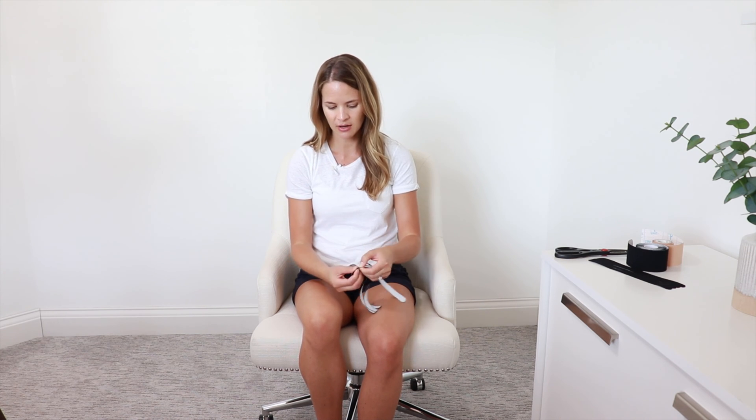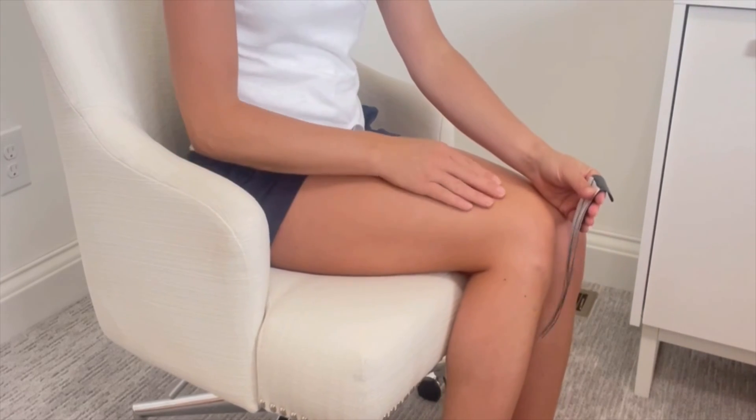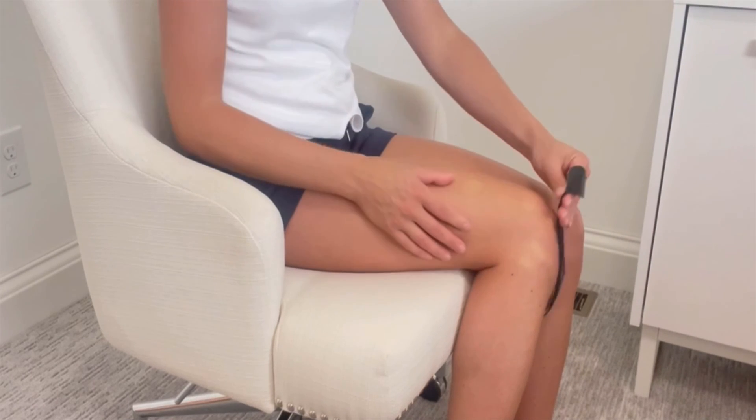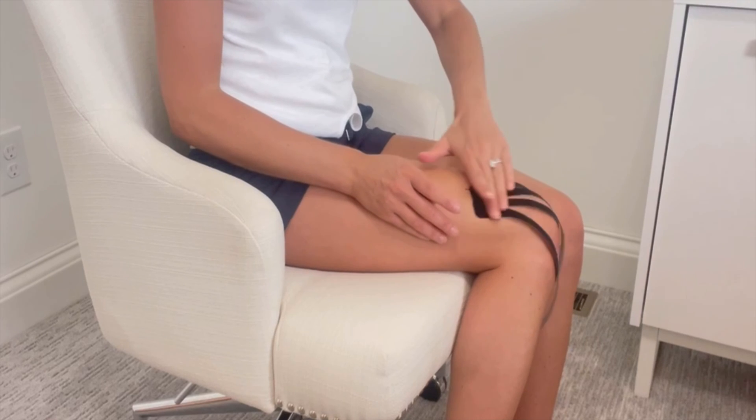Remember, make sure that you don't have any oils or lotions on the knee or the skin before you apply it. When it comes to knee swelling, we really want to get as much full coverage over the area that's swollen as possible. We'll do one strip on the inside and one on the outside. The anchor should be closer to your body versus your foot, and the strips will come down towards your foot over the knee, crisscrossing over themselves. I like to do this with a bent knee to give a natural stretch to the tape versus trying to give a lot of tension. First, tear off the paper backing of that anchor piece, and start on the outside, just three or four inches above the knee itself. Apply that down and rub it in, because the warmth is what activates the adhesive.